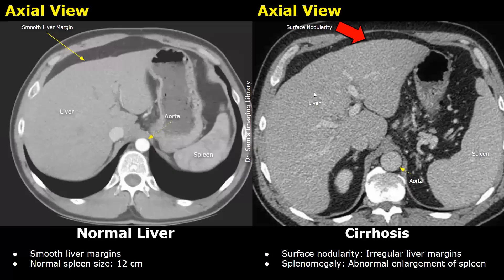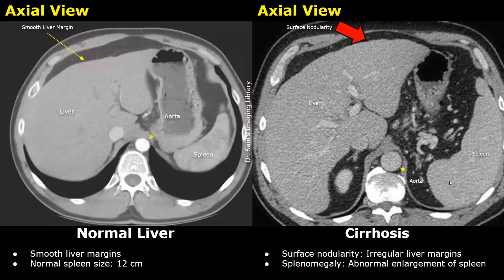These are CT images in the axial plane. On the left side we have a normal liver — smooth margins, no rough margins are seen. In the image on the right we have liver cirrhosis; the liver margins are irregular. This irregularity is called surface nodularity. Another feature usually seen in cirrhosis is splenomegaly — the abnormal enlargement of the spleen. The normal spleen size is approximately 12 centimeters. You can compare the normal spleen with the enlarged spleen in the cirrhosis image.